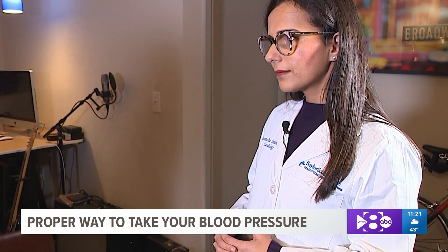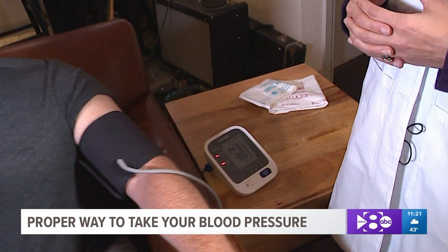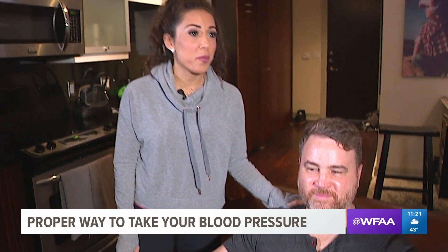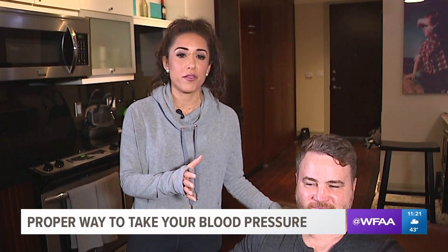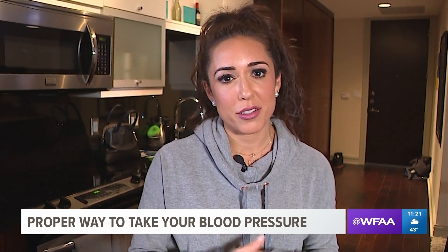We are now seeing Jared's reading — it's 143 over 90, which would be considered high. So we've got some work to do, Jared. Thank you both so much. This is incredibly useful information. If you have any questions, you can reach out on social media and I'll get you connected to the right folks.